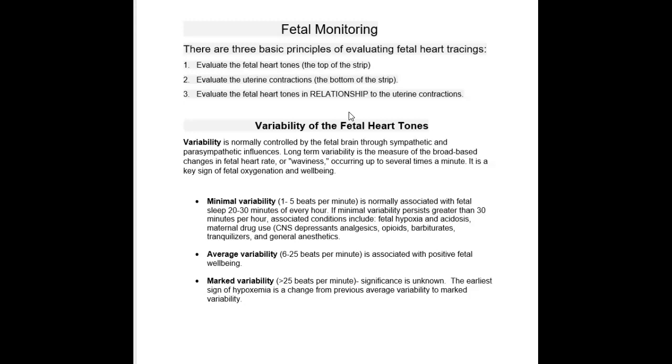The best way for me to describe this is like, when you see a cute person that you may be interested in, you know how your heart kind of flutters and your heart rate goes up? Well, that's because you have your sympathetic nervous system. It makes you excited and it causes your heart rate to change. Well, that's the same thing with the fetal heart tones. If the sympathetic and parasympathetic nervous system is intact, you will see variances of fetal heart rate.